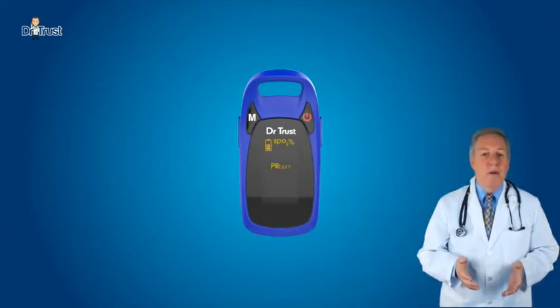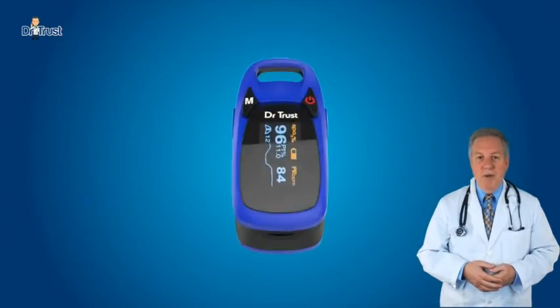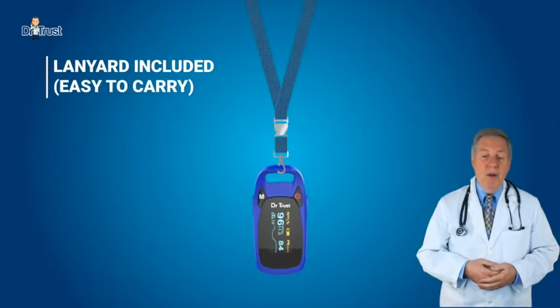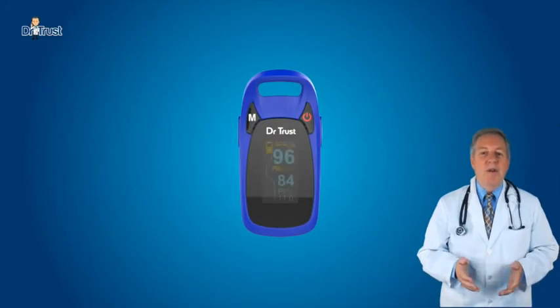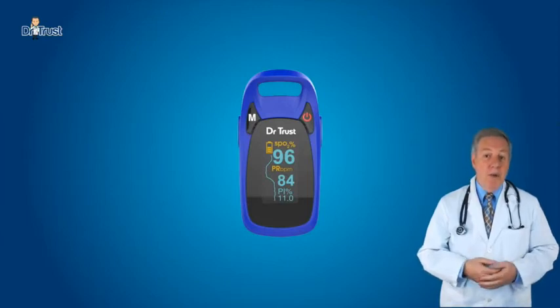Read the corresponding data from the display screen. The product will automatically power off if no finger is detected for more than 16 seconds. The product is lightweight for carrying and easy to use, and comes with a lanyard. You can manually adjust the direction of the interface.